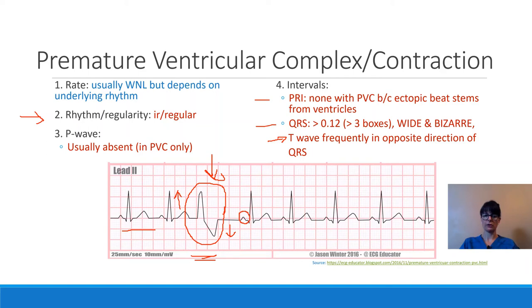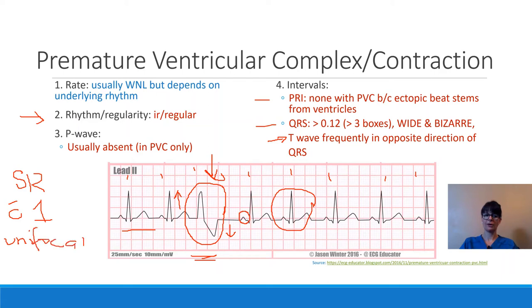PVCs always have an underlying rhythm. In this example, analyzing the regular-looking beats, they appear sinus. Counting the beats over the six-second strip gives a rate of about 80. So this would be interpreted as a sinus rhythm with one unifocal PVC. We wouldn't call it a normal sinus rhythm because the PVC isn't supposed to be there — whenever there is an abnormal beat within a sinus rhythm, we no longer call it normal.